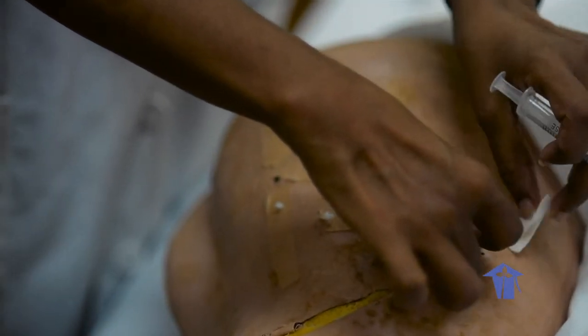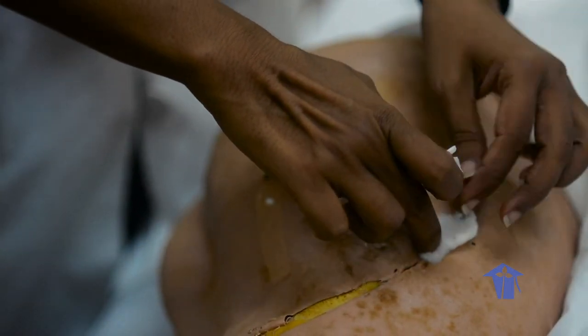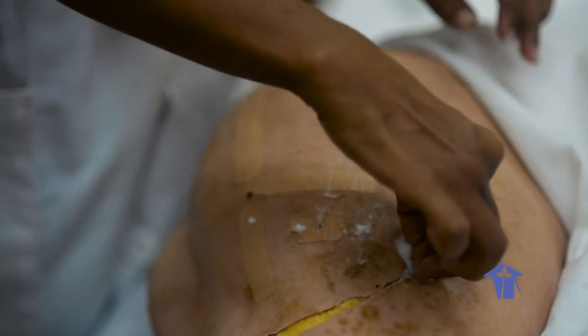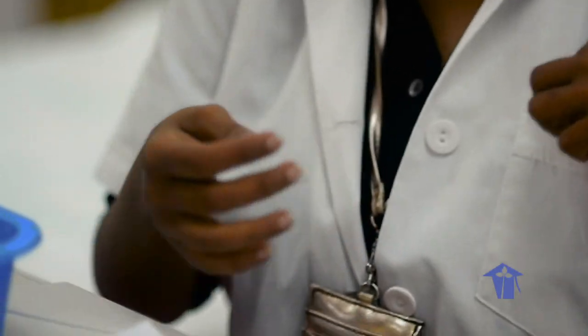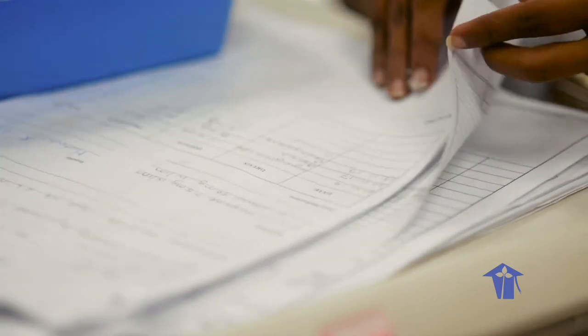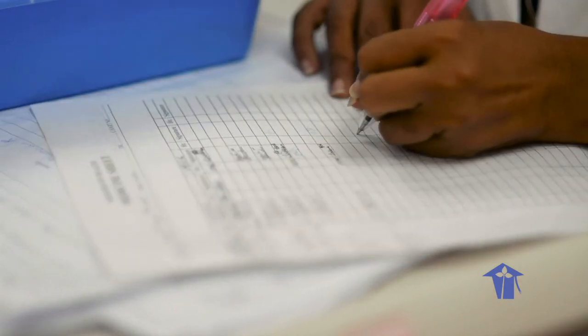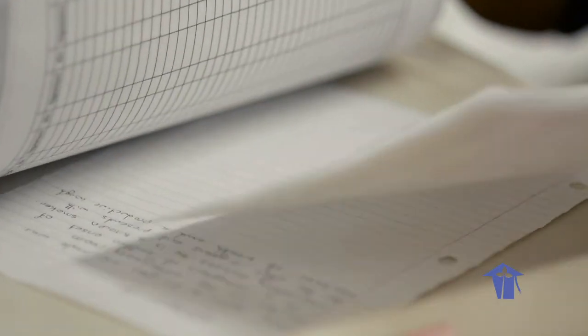Never recap needle. Place needle in the appropriate receptacle. Assist the patient to a comfortable position. Okay, patient is comfortable. Perform hand hygiene and document. And that is the end of intramuscular injection.